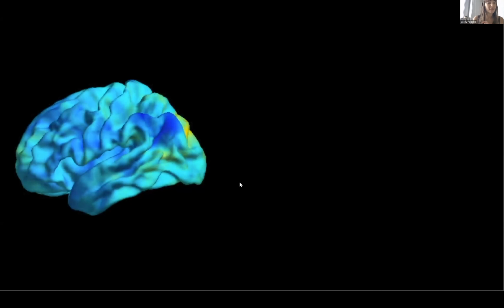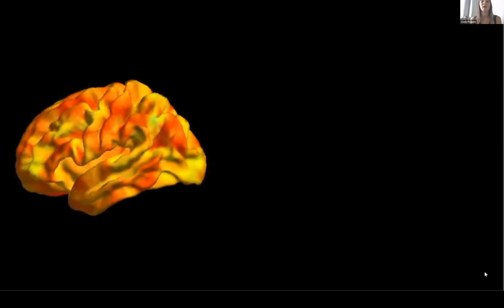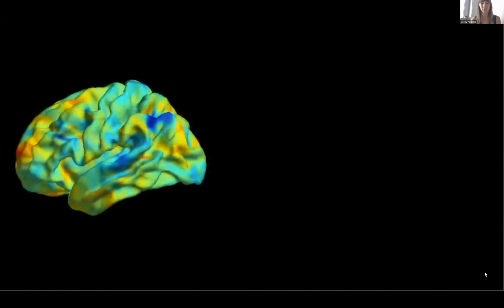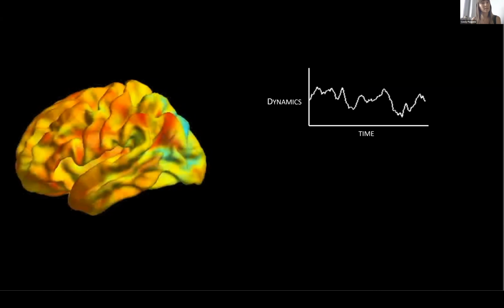Okay. So in vivo neuroimaging, I think, has allowed us to really comprehensively characterize the macro-scale landscape of the human brain. For example, you see a functional MRI here, and it enables visualization and analysis of ongoing fluctuations in cortical activity. I think this video epitomizes the balance that we strike with in vivo imaging between spatial and temporal resolution. And this has profoundly changed our understanding of the dynamics of the human brain that occur from second to second, but also across the lifespan and even across evolution.